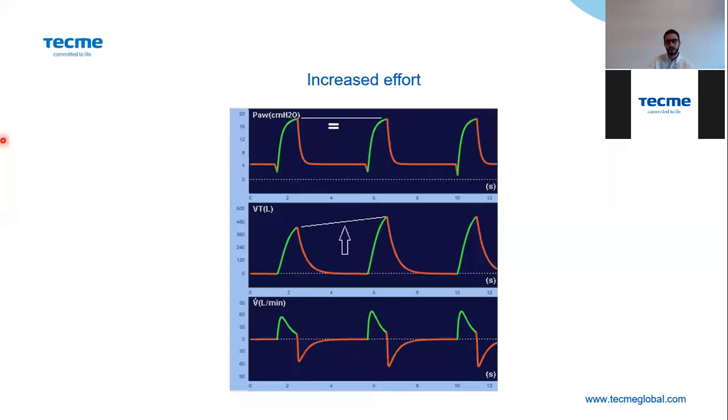And what about the inspiratory volume? That means the tidal volume. The tidal volume, yes, it will increase. Why? Because this is a pressure mode. You always have to remember that pressure support mode is a pressure mode.